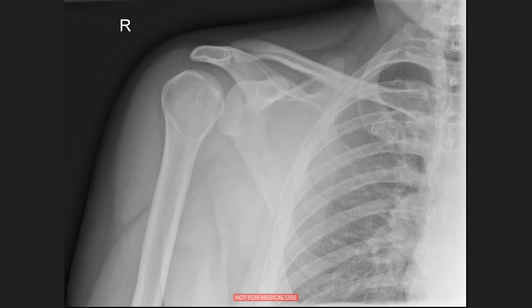This is another case of posterior dislocation. Again you can see that the glenoid is not completely congruent with the humeral head, and again the humeral head has a light bulb appearance.